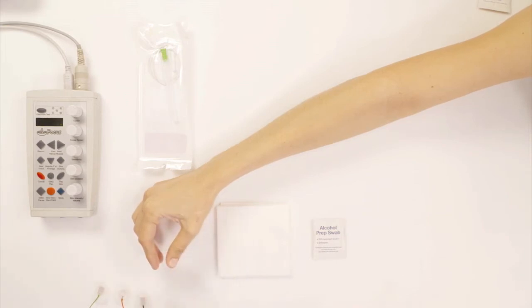Now let's see what electrodes we're going to need to plug in. In this case, just like in every nerve conduction that we've done, we need to plug in three electrodes, but there's a slight difference. The black active electrode is going to be replaced by the needle, while the ground, green electrode, and the reference electrode are going to stay the same.